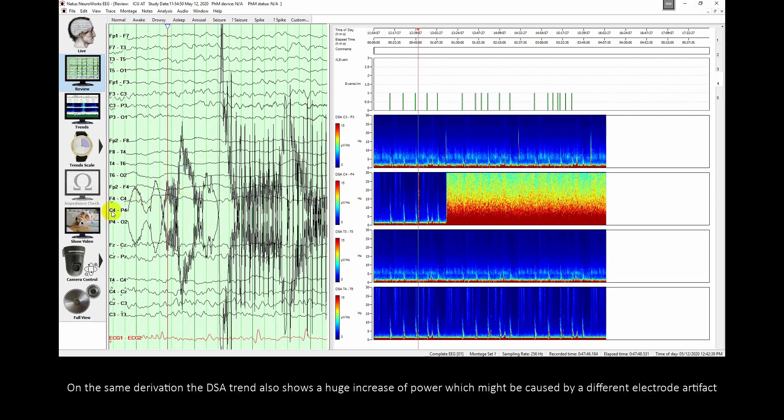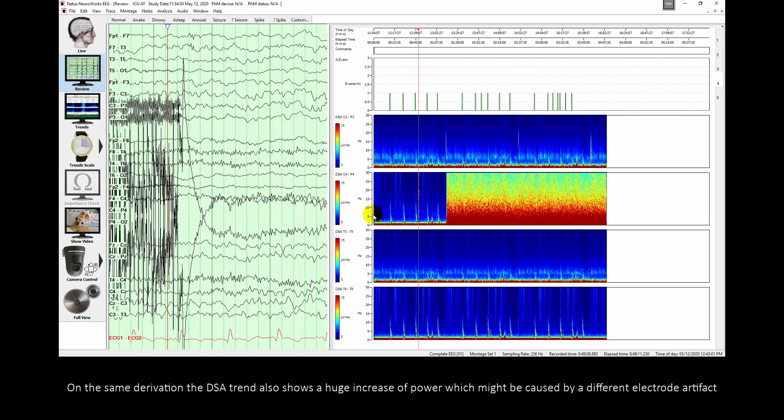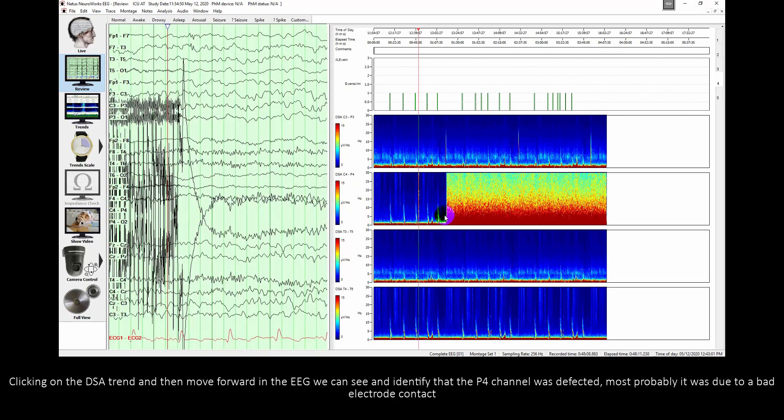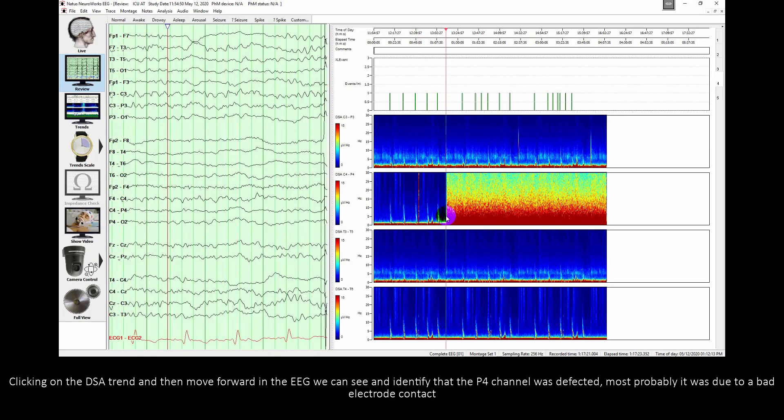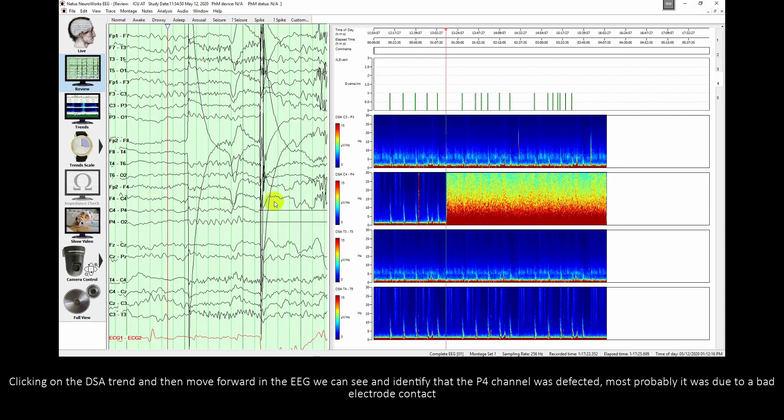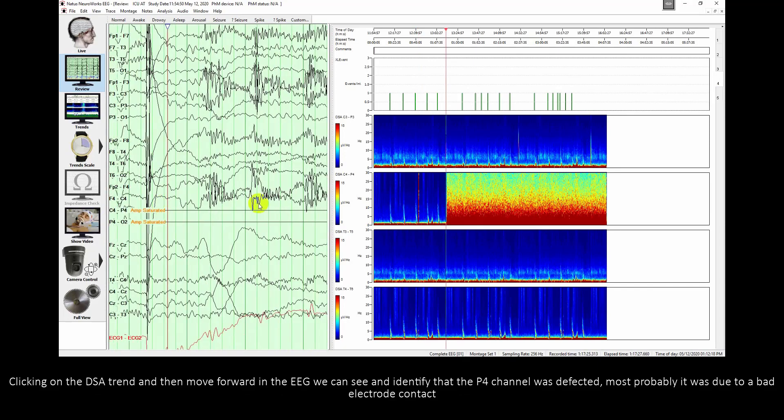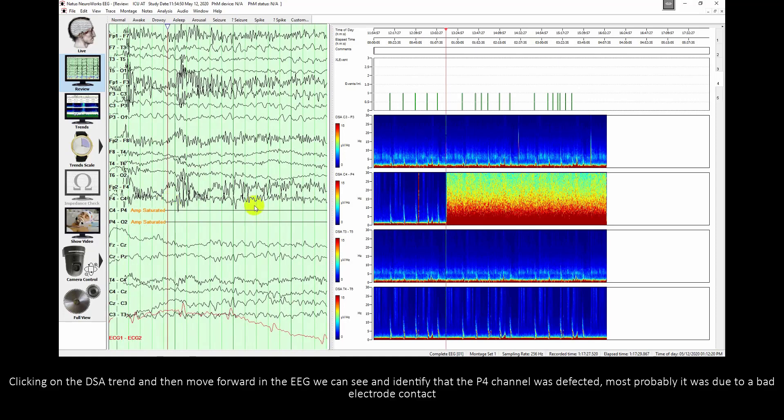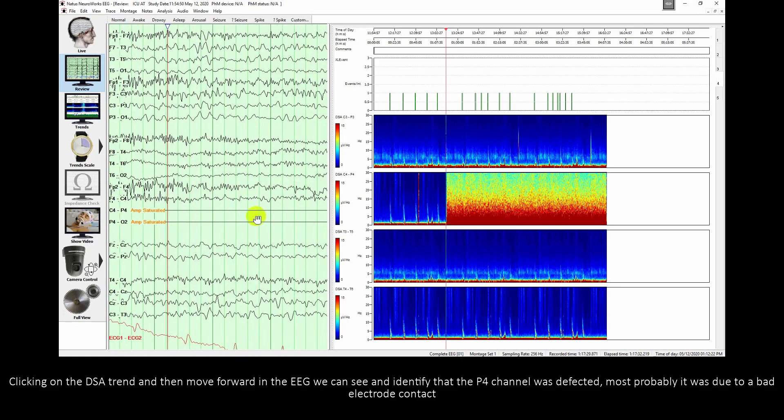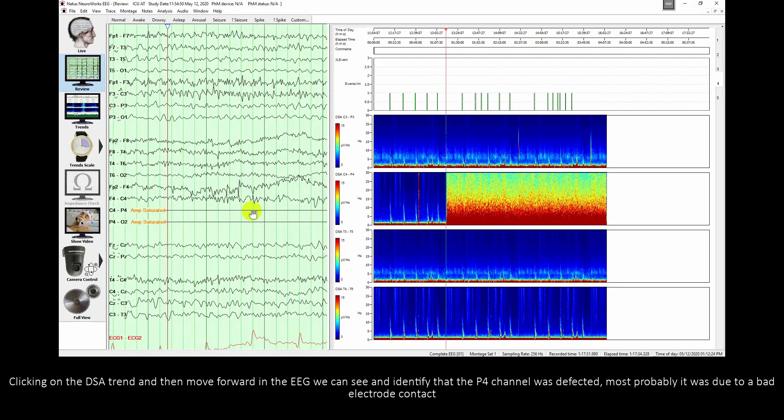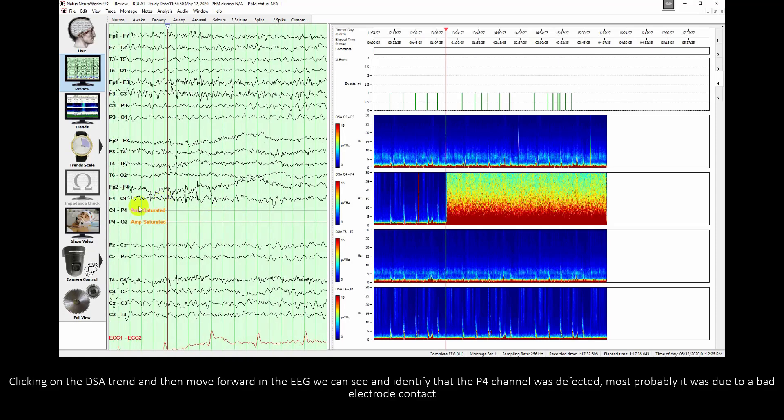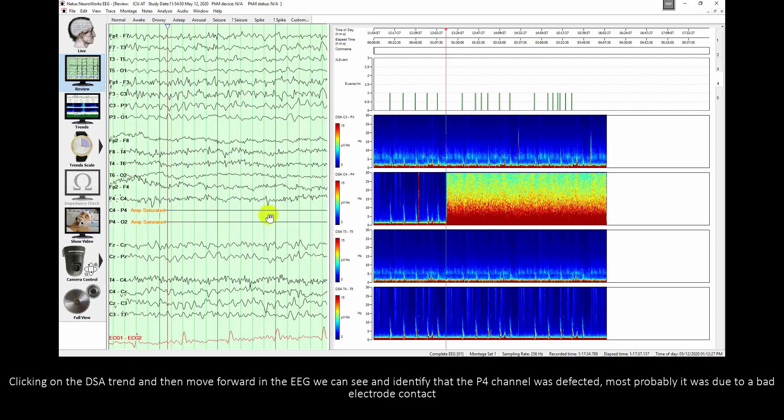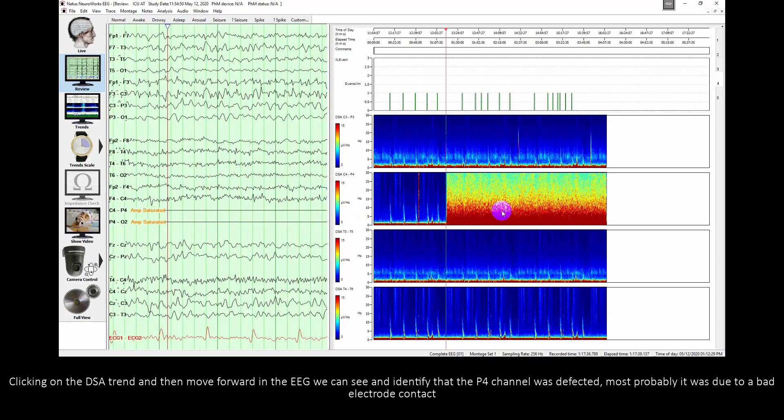On the same derivation, the DSA trend also shows a huge increase of power which might be caused by a different electrode artifact. Clicking on the DSA trend and then move forward in EEG, we can see and identify the P4 channel was defective. Most probably it was due to a bad electrode contact.